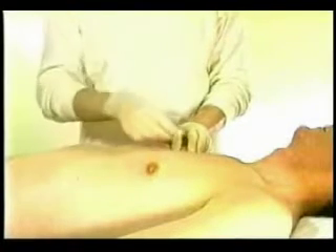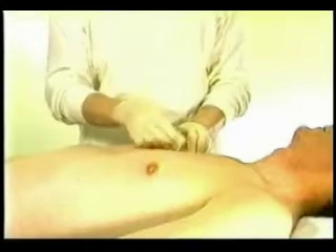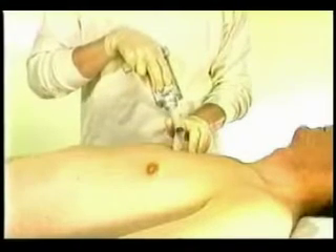The skin between my fingers is cleansed with a simple alcohol swab. Now, without moving my fingers, holding the target, I pick up the instrument and get in position.